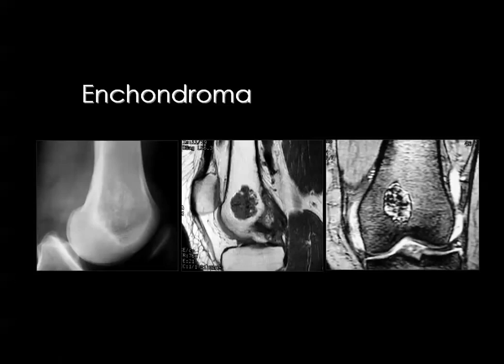Then the radiologist will leave the whole evaluation of the knee and will concentrate on this particular lesion, which is an incidental finding, and starts to describe it in full detail, considering the signal, the length and the width, and finally, as I see frequently in the reports, it may recommend the lesion to be biopsied either by CT guided or by surgical biopsy.